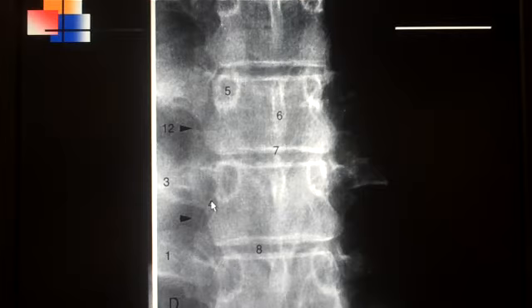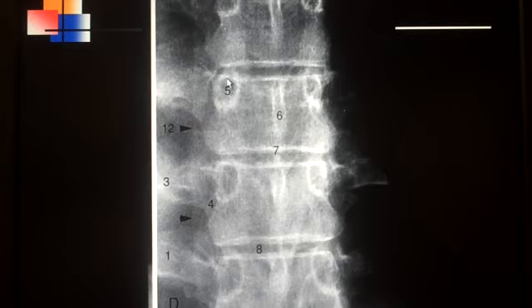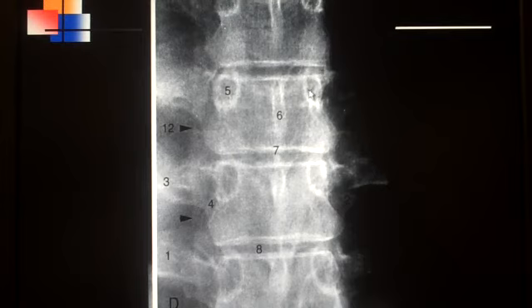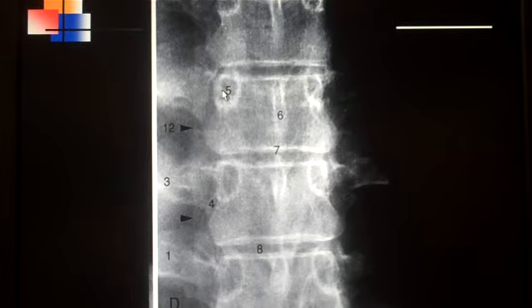Number four is labeling where the rib comes in and articulates with the vertebral body, which is called a costovertebral joint. Number five is labeling the pedicle right here, and the pedicle should be nice and symmetrical — meaning this size compared to this side. You'll use that in your full spine X-ray analysis class to help determine body rotation. If you look at this particular segment, this pedicle looks a little bit wider than this pedicle, and so this is the side of body rotation, and this is the side of spinous rotation. The more elongated or elliptical-looking pedicle is the side of spinous, and the wider or fatter-looking one is the side of body.